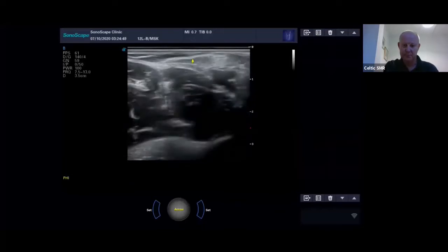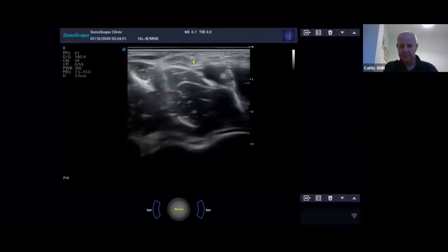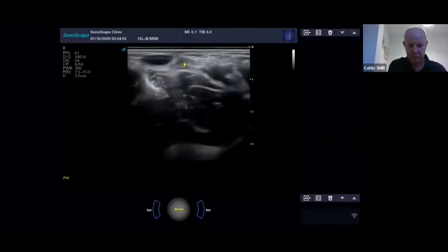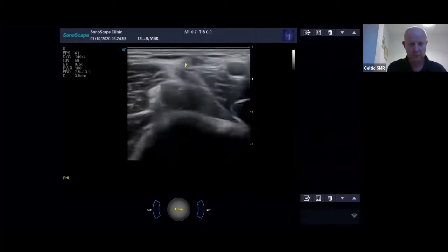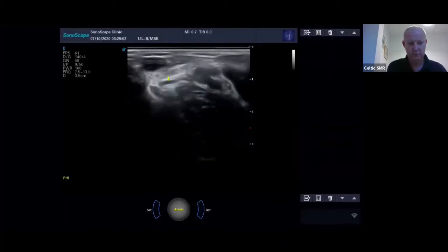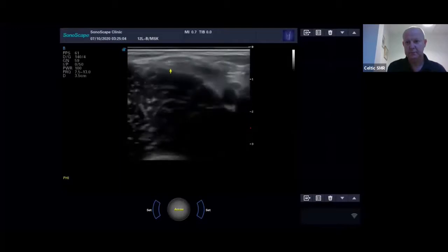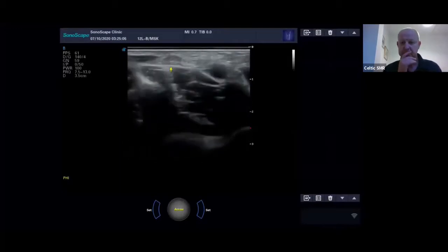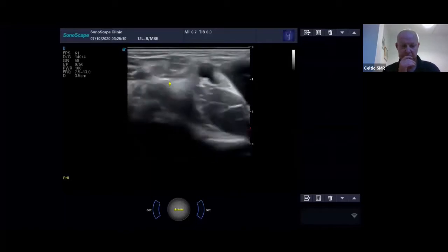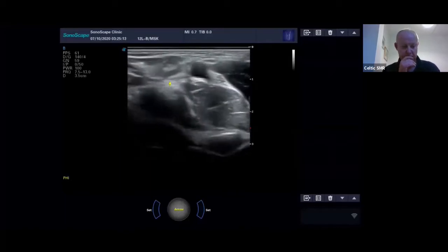And you can see that coming down here. And the trick, if it gets quite difficult because it will dive, is to follow it down. Here it is, drying up, follow it down. So this is still the biceps tendon coming down. And then it starts to dive very, very sharply. It's quite difficult to follow.